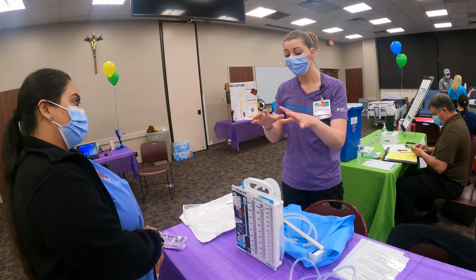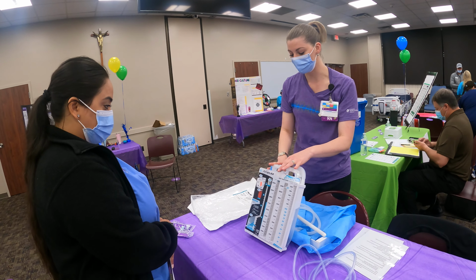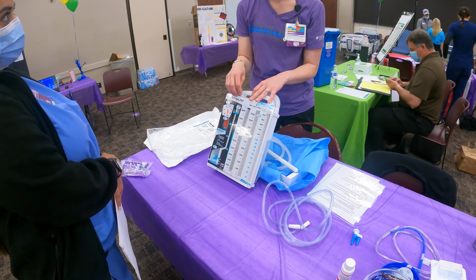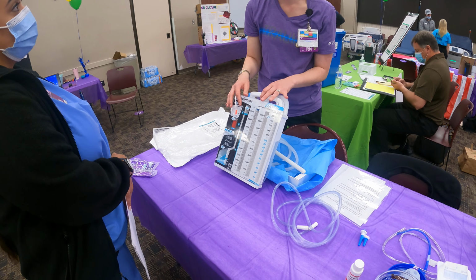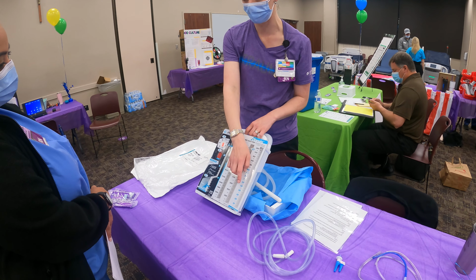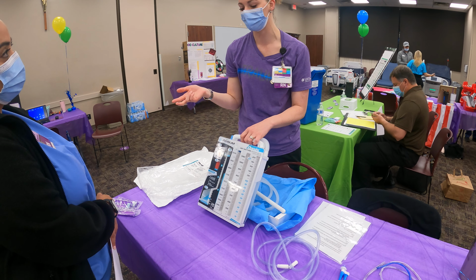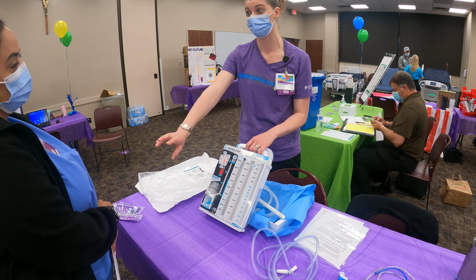Okay. This is a collection container, right? So if we have a pneumothorax, we don't expect to be any output at all. If we have a hemothorax, we expect it to be blood, pleural effusion, maybe some different colored substances come out, right? So as this fills up, at the end of your 12-hour shift, we want you to write right on here with a Sharpie or some sort of marking your initials, date and time, so that way we can see when we walk into the room how much has been put out for the last 12 hours.